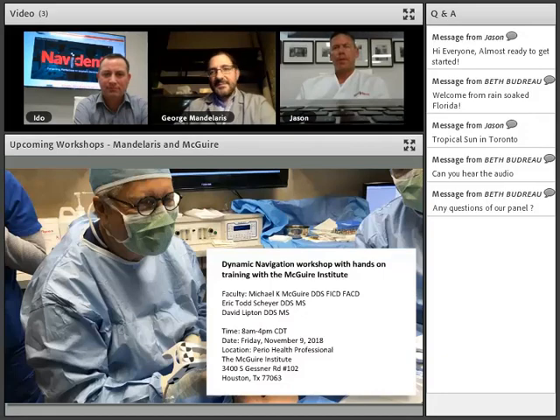So, regarding the head tracker, of course, as with all of this, we're in a beta phase. George alluded to the fact that we go with 3 points to trace, and then back for 2 points, 4 points to trace. Just for your information, the latest update, which you now have, we're back to 3. So you can do 3. And that's up to you.